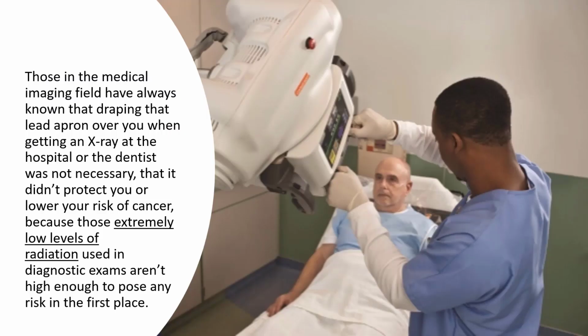In the last few years, there's been a difference in emphasis upon radiation protection. Previously, it was sort of like, if you get 1 photon of energy in there and it actually hits the nucleus of the cell and gets to the DNA, you can cause cancer. Well, what's the probability of that? Realistically, using low levels of radiation, as long as you're doing the exam correctly, not being cavalier, trying to use the minimum amount of radiation to get the proper examination or exposure, and matching the exposure to the information that you need to capture.